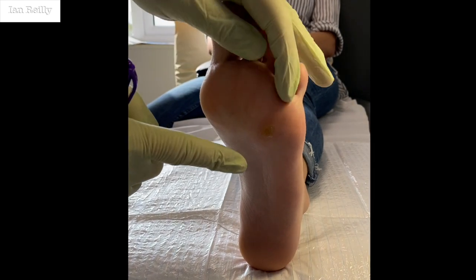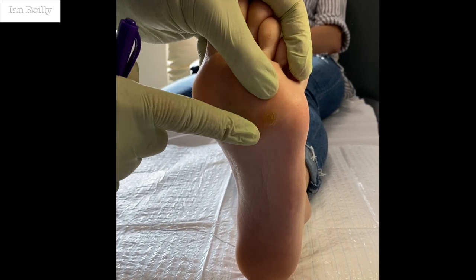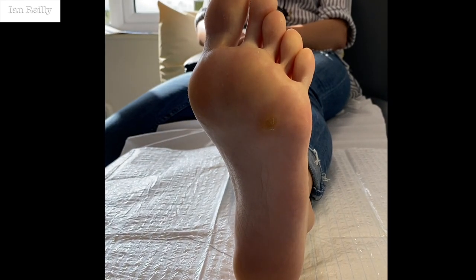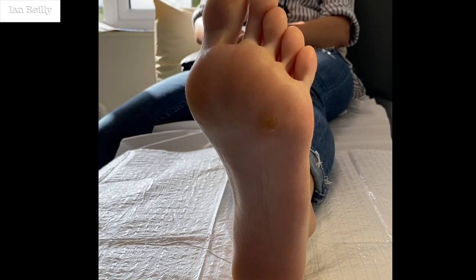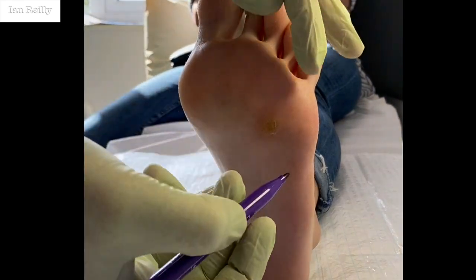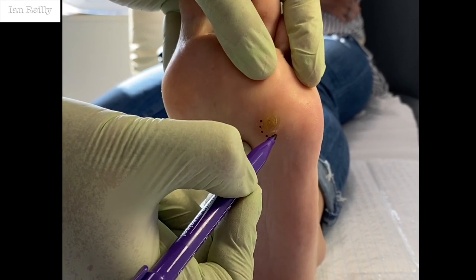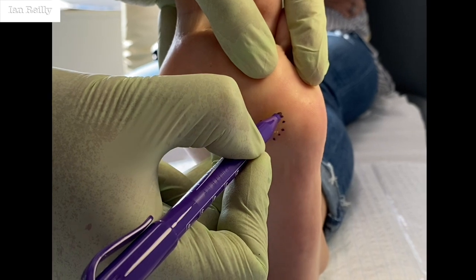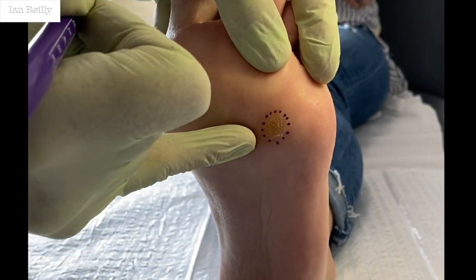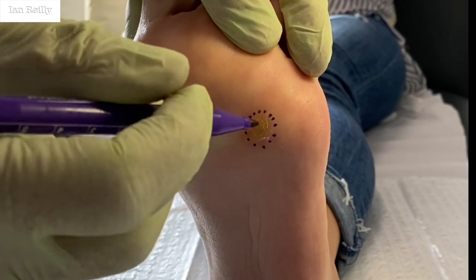This young lady has got a really rather nasty verruca cum corn here, and I think it's really more a verruca that's turned into a corn. So there's our lesion — we're going to take this out at about this size. It's been here for about a year, really quite sore. She has tried various topical remedies, so we're going to cut it out and let it heal in by secondary intention.